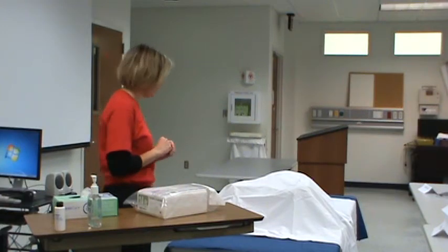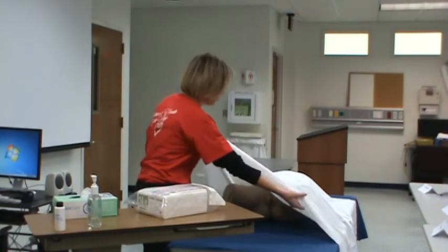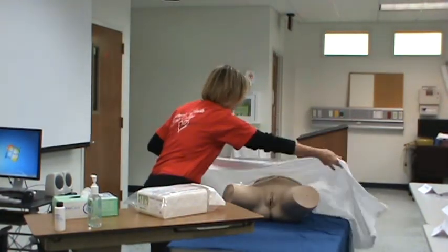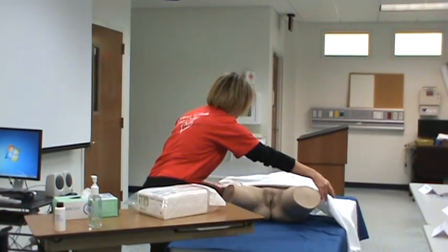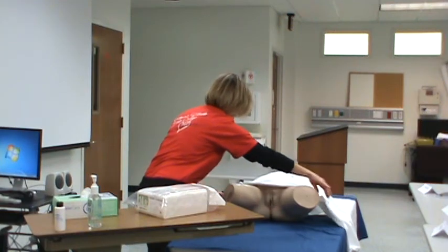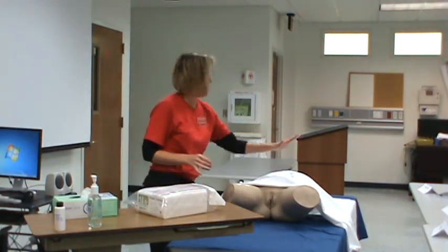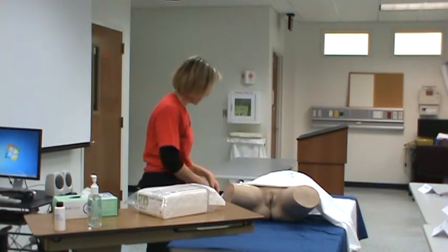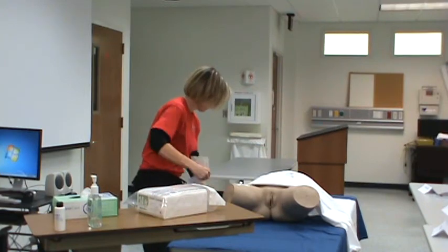And she says, okay. And so, because I'm the only one in the room, I'm going to give her as much privacy as I can, but yet still get to the area, the vaginal area, so that when I'm ready to do anything, I don't have a whole lot of stuff in this area to get in my way. Can you all see this? Good, good, good.